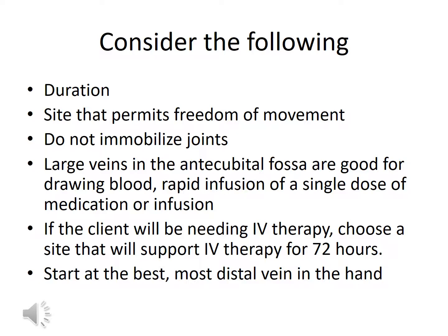If the client will be needing IV therapy for an extended period of time, choose a site that will support the IV therapy for at least 72 hours so that it can be changed out. Again, start at the best and the most distal vein of the hand and work your way up the arm.